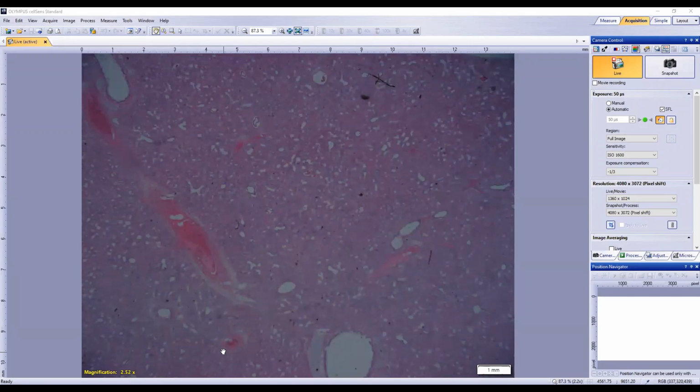But what I'm getting at here is that we're going right back to the very basics of histologic examination. In every tissue there are compartments, and in every compartment there are subcompartments. So to do a thorough examination, you go through and mentally check off each one of those.